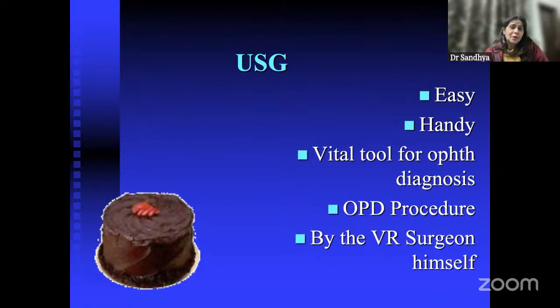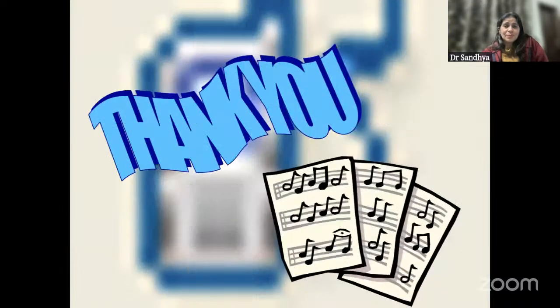Like tomorrow, if I have to take this patient up for surgery, I should know where the tear is, where is the front, where I will place my ports accordingly. So all these things are very important. So in the end, I will say ultrasound is a very handy tool for diagnosis, a non-invasive investigation of choice. It could be just done like an OPD procedure. So very handy and very easy, and best done by the VR surgeon himself. So this is the whole importance of the ultrasound.